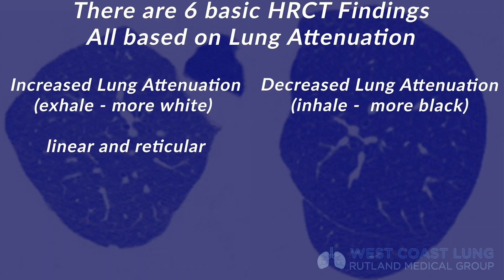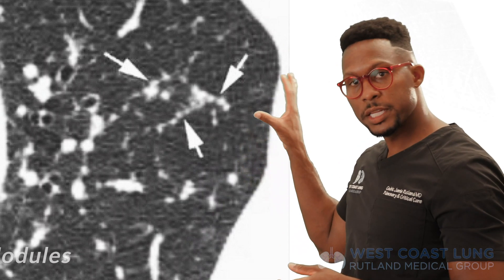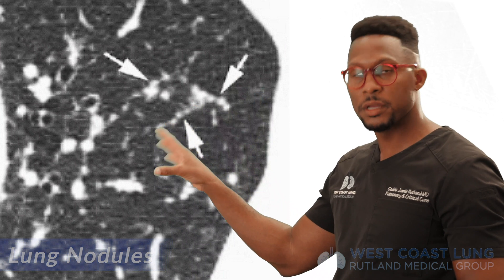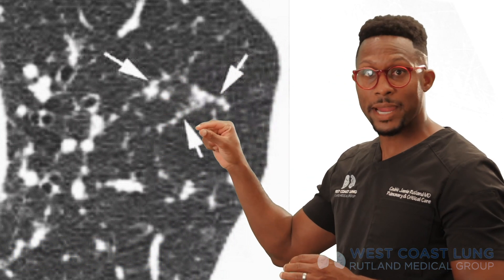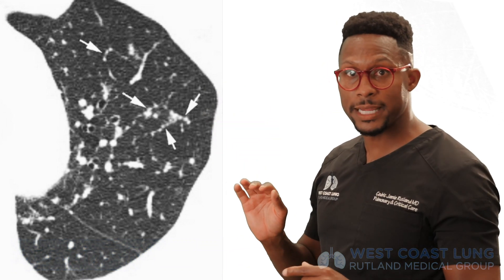The second finding is nodules or nodular opacities. A nodule is any well-circumscribed soft tissue that is three centimeters or less in size. If it's three centimeters or more, we call it a lung mass; if it's less, it's a lung nodule. When you look at the nodules on this CAT scan, these nodules are not only well-circumscribed and less than three centimeters, but they're also located on the interlobular septa — so we call these interstitial nodules. You can go to your attending and say: I see well-circumscribed interstitial nodules on this CAT scan of the lung.